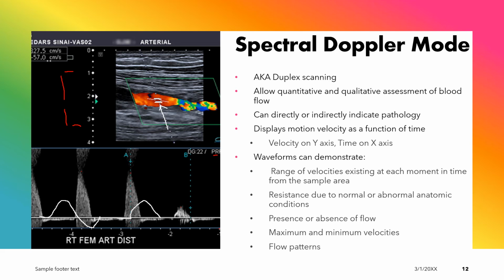Now finally, if we were following a stenosis or past a stenosis, and that stenosis really was not letting the adequate amount of blood or the expected amount of blood flow through, what we might end up seeing in that case would be something that's very low resistance. So in this case of a post-stenosis blood flow pattern, what we might see is during systole, there's not the same volume of blood that there was pre-stenosis. And so we'll again see kind of a tardus parvus waveform. And then because there's just a lack of blood, it's basically going to drop down to the baseline. Nothing will occur until the next cycle. And we call this a monophasic waveform.